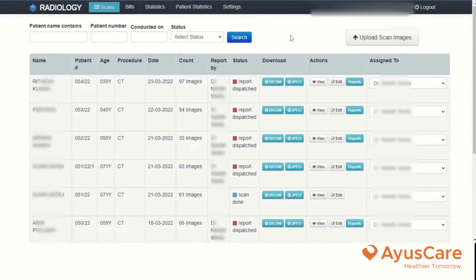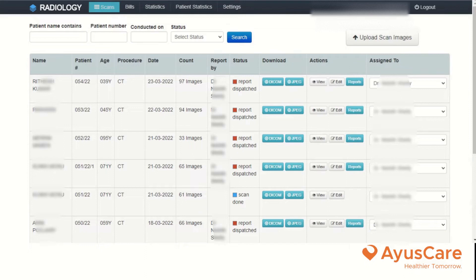Once you login, you will be presented with all the patients whichever you have consulted. Here you can see the name of the patient, age of the patient, procedure conducted — here it is CT — date of the procedure conducted, number of images generated, who has done the report, report status, and also for a patient there will be two things to be done called Dicom and JPEG.